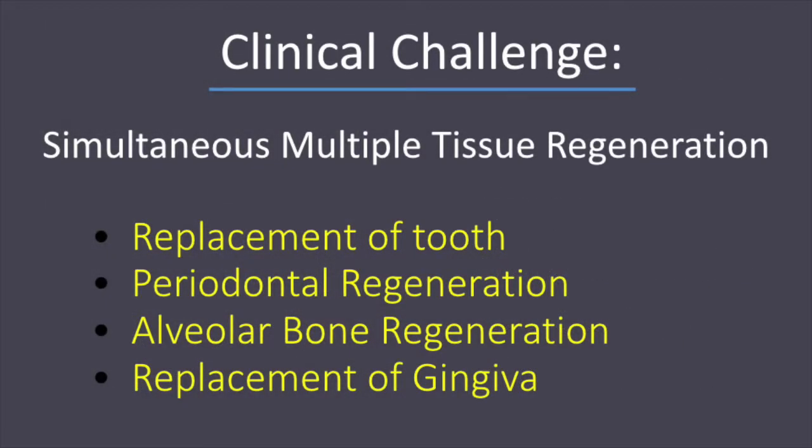A significant challenge, however, is the periodontal damage to the lateral incisor tooth. There is no obvious bone on the distal aspect of this tooth or even the labial aspect. There is a limited amount of damage to the mesial aspect of the premolar itself. Now, in order to create a stable reconstruction, all 4 of these defects have to be corrected. A simple bone graft will not likely reverse the periodontal damage on these 2 teeth, especially the lateral incisor tooth.